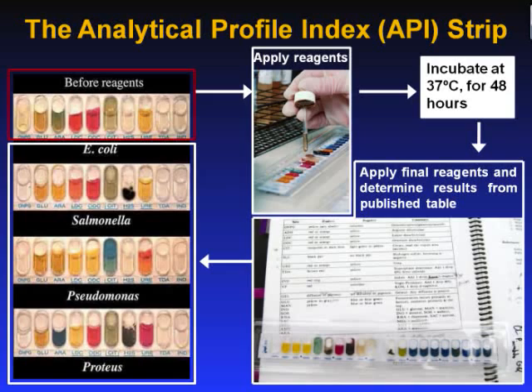degrees Celsius. The reagents in the cupules are specifically designed to test for the presence of products of bacterial metabolism specific to certain kinds of bacteria. After incubation, each cupule is assessed for a specific color change indicating the presence of a metabolic reaction that sheds light on the microbe's identity.